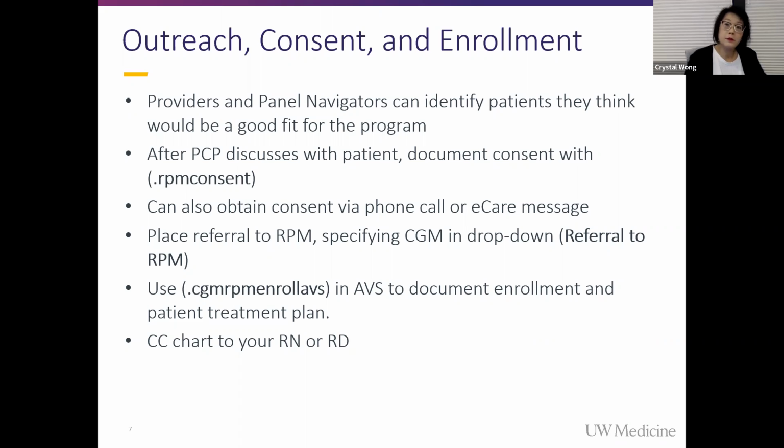I think for most of you, this will be done face-to-face or via telemedicine in an actual visit. You're doing a diabetes follow-up. You're saying, hey, what do you think about CGM? Would this be a good fit for you? And the patient says yes. And so you document the consent using this .rpm consent in the chart.